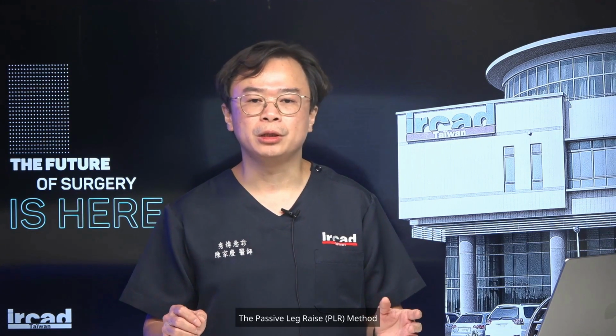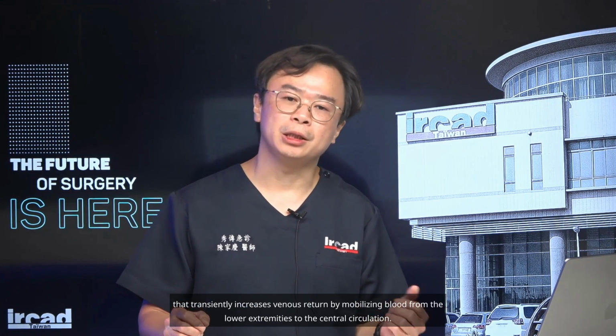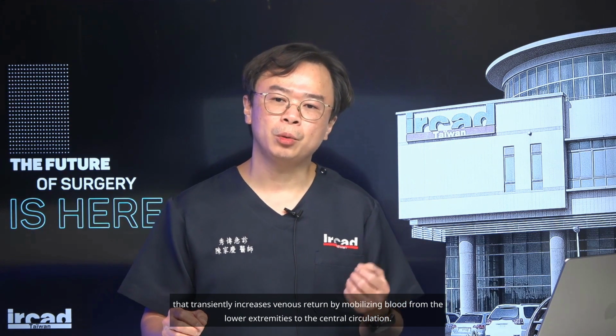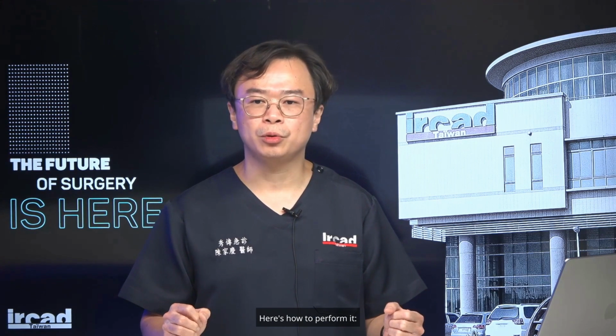The passive leg raise, PLR, method. The passive leg raise test is an elegant, reversible fluid challenge that transiently increases venous return by mobilizing blood from the lower extremities to the central circulation. Here's how to perform it.